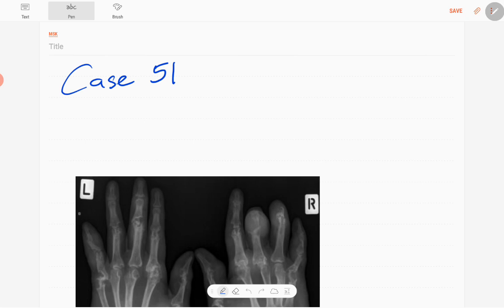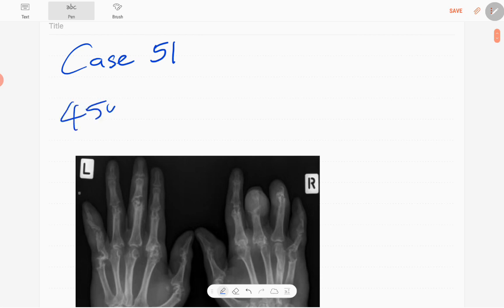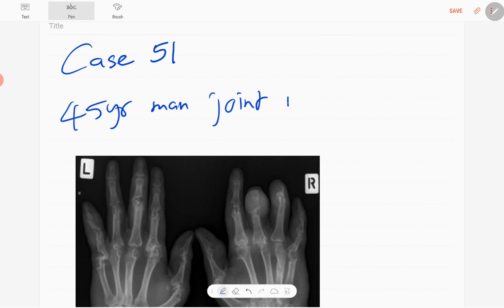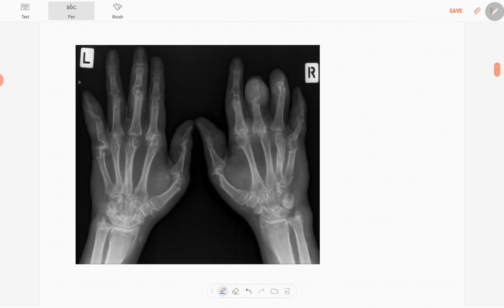Hello everyone, this is case number 51 of the MSK series. Today's case is a 45-year-old man presented with multiple joint pain in both hands. This is the anteroposterior radiograph of both hands in a skeletally mature patient.